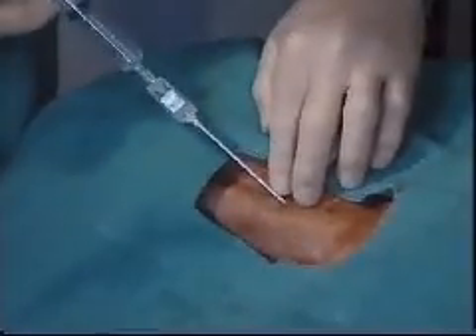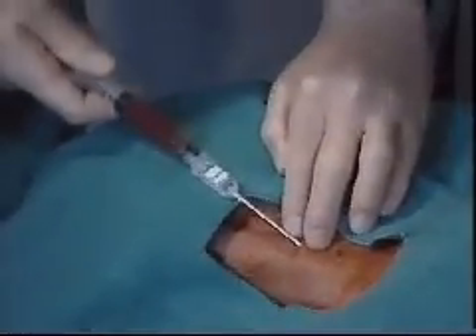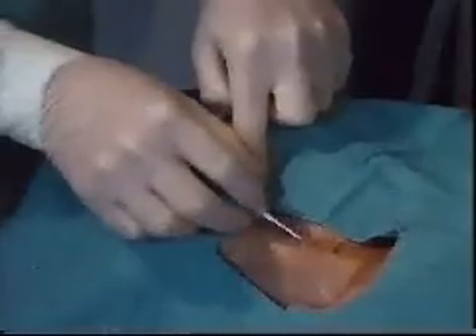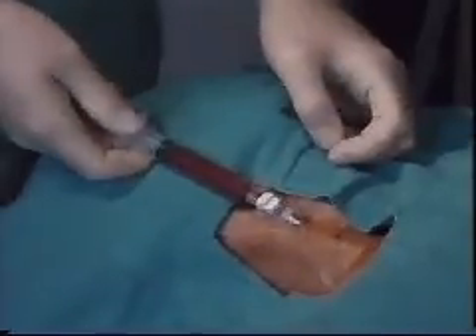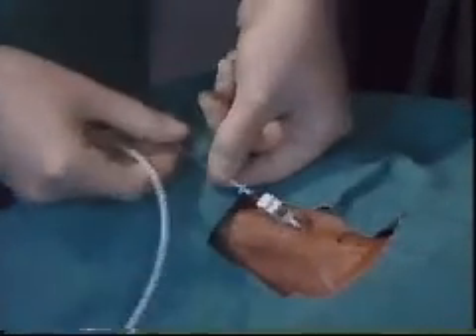The introducer is advanced into the correct position in the vein. The flow switch is turned off so air does not enter the catheter. The syringe is reattached for aspiration. The flow switch is turned on and venous blood aspirated. When it is confirmed that the catheter is in the internal jugular vein, the Seldinger guide wire is advanced through the vein and into the superior vena cava.